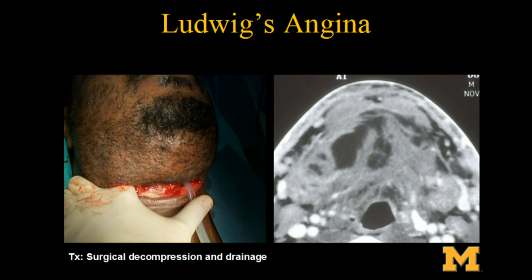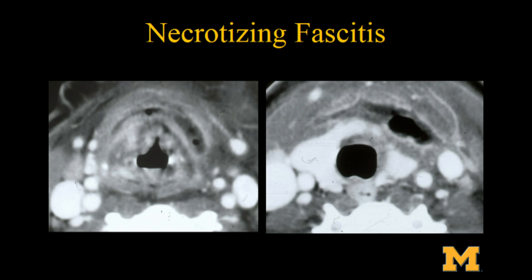Now, this is a disease entity that you can make the diagnosis, again, in the middle of the night. And the answer to this is the following. How do you make the diagnosis? First of all, normal or abnormal, right? Abnormal, right? What's the abnormality that we see here? Besides all the edema, because we can see edema after a lot of disease entities, but what's the finding here that tips you off that this is more than a regular infection?